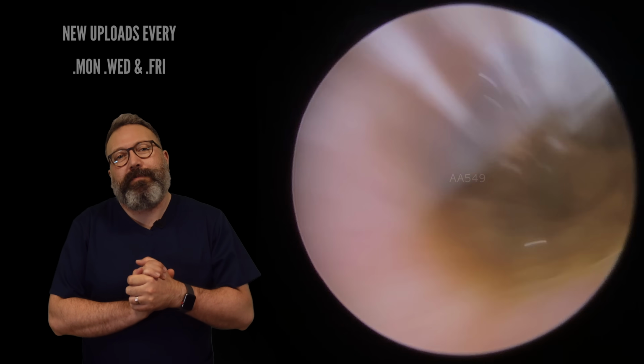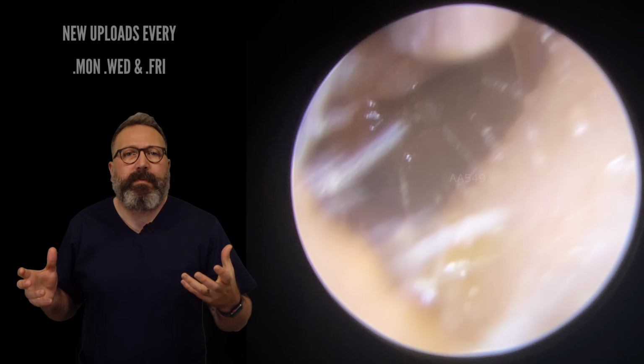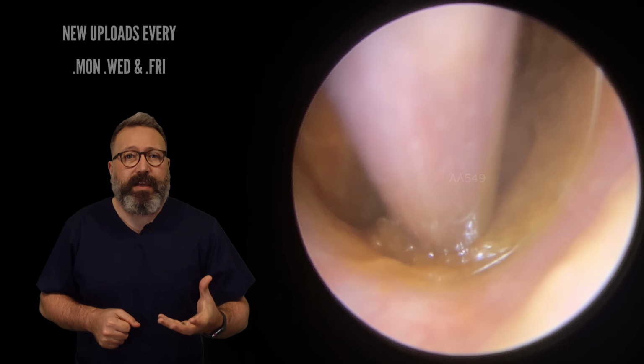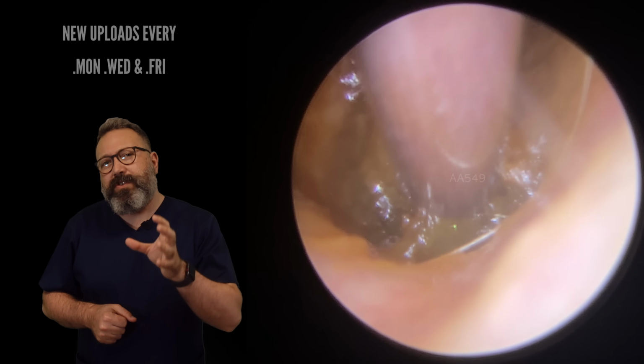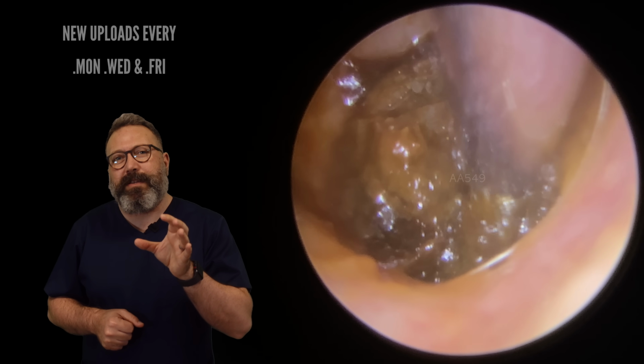Now this patient's come through, it's just one patient in this video today. Patient's come through feeling really blocked up in both sides. This was actually the better hearing of the two ears, you can see here. But we've got this very, very deep section of wax here. Would you say this is impacted? I'm not too sure. I think this is probably just ended up in this particular section.